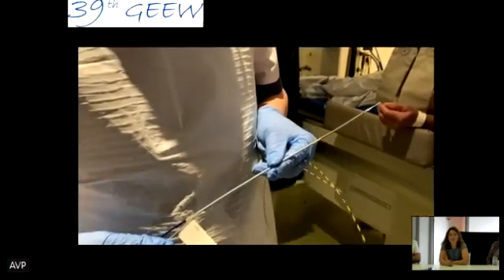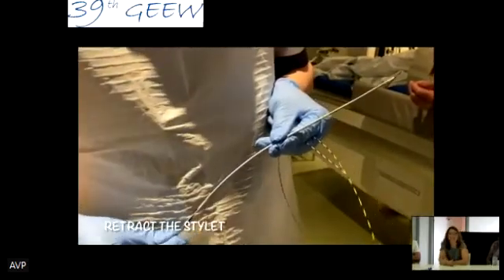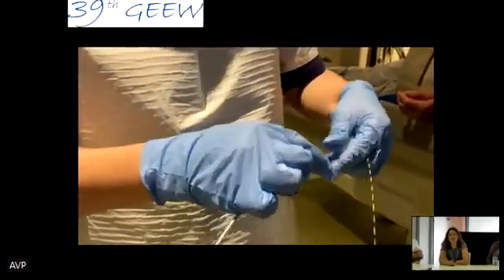So this is for the multiple stenting. And I think that we also have a video with the SEMS. This is the metal stents. There are many different models, and we will show them also. We have some here. So we will retract the stylet. We put it on a guide wire.